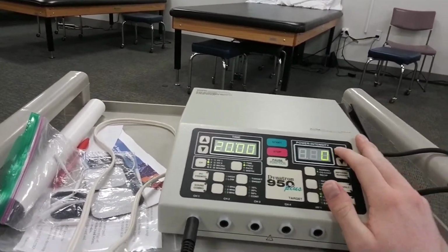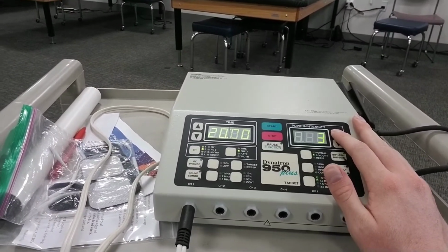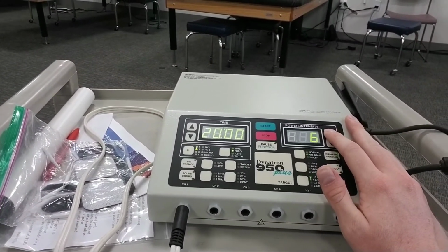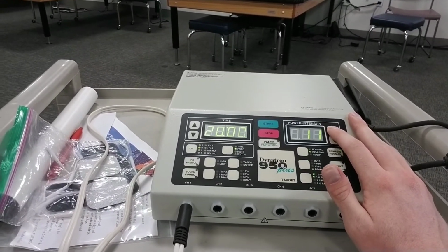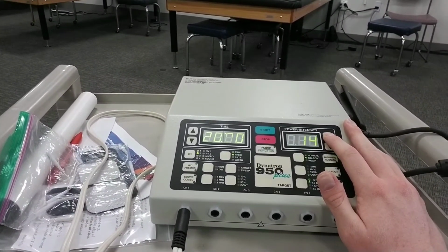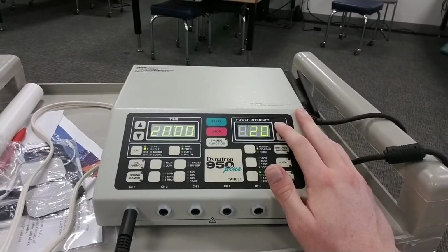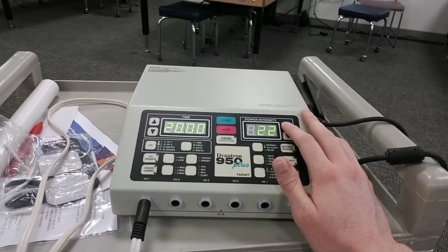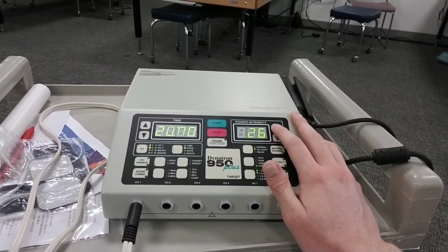Let me know when you start to feel it. Starting to feel it at all yet? Oh, yeah, there we go. Starting to feel it now? Mm-hmm.